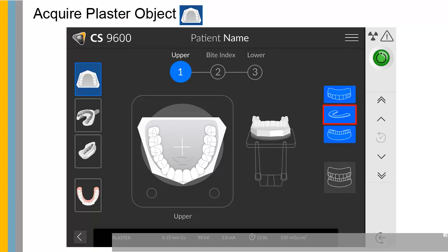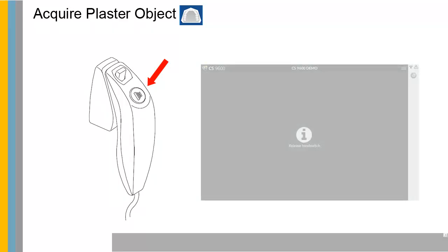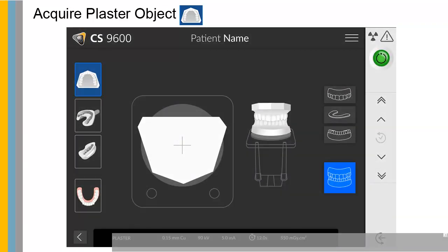To acquire the bite index, select the bite index acquisition mode. Launch the X-ray with the remote control. Press and hold the exposure button until the end of the acquisition is indicated by the on-screen release switch message. When the acquisition ends, the acquired image appears on your screen. Repeat this process for each object.